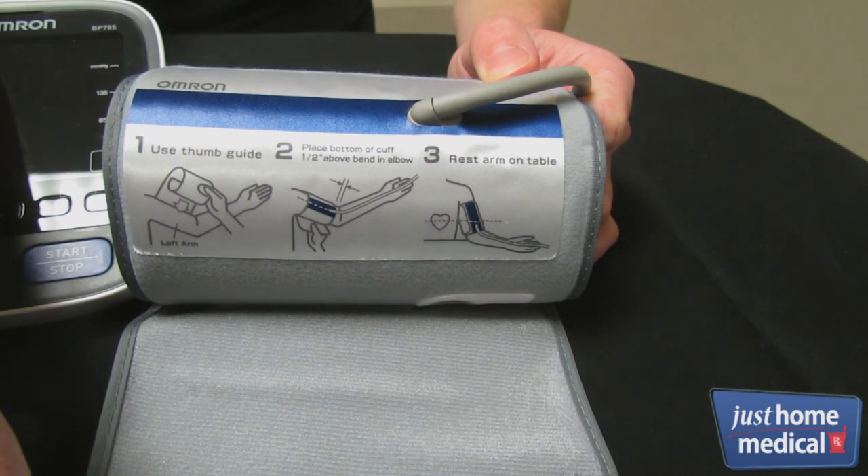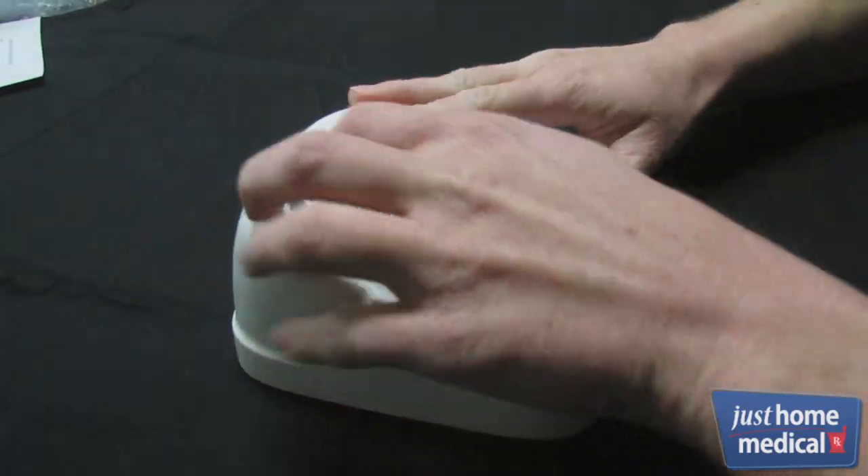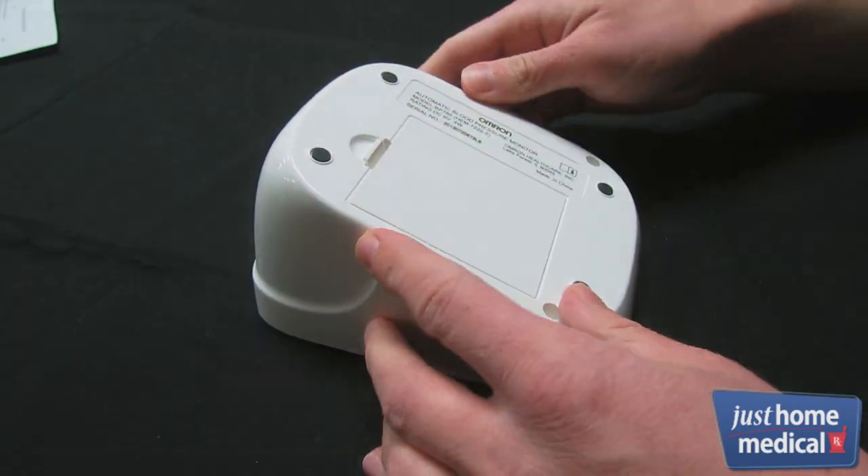The cuff features a cuff wrap guide to help with positioning. To get started, insert four AAA batteries into the bottom of the unit, or plug in the AC adapter.